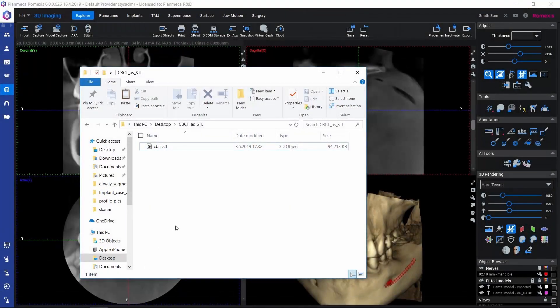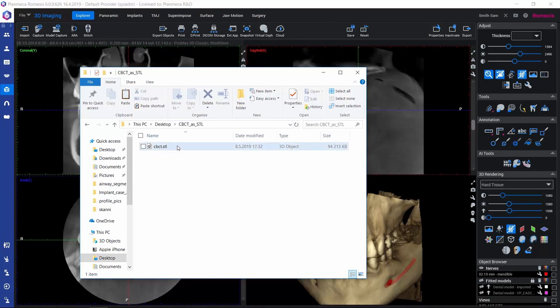Now if we go and check how our file looks, we can see that we got our surface model in STL format here in the folder that we specified. Thank you very much.